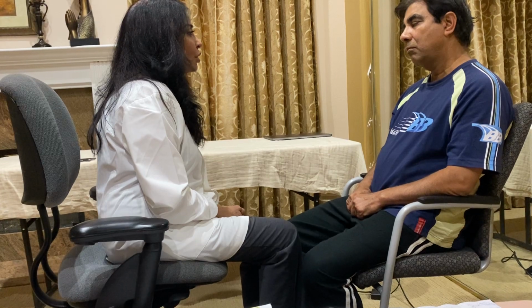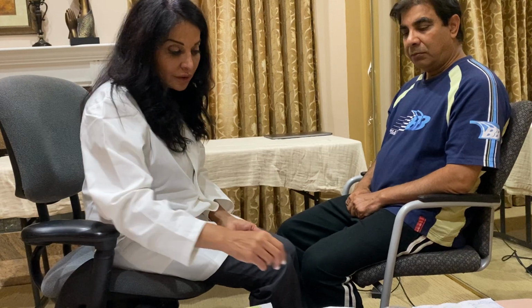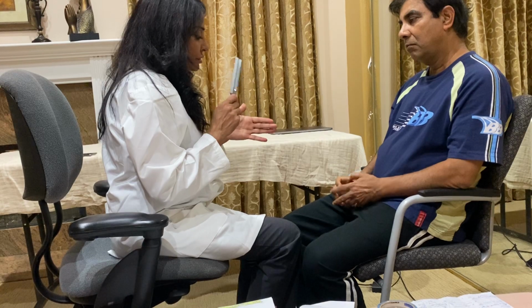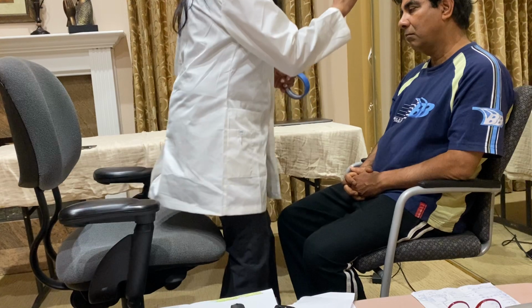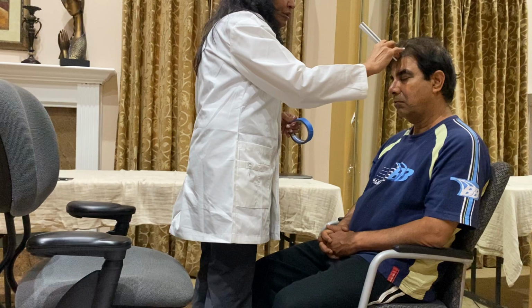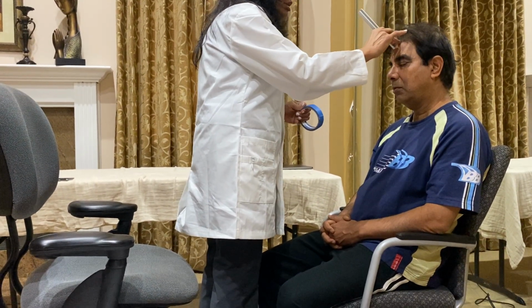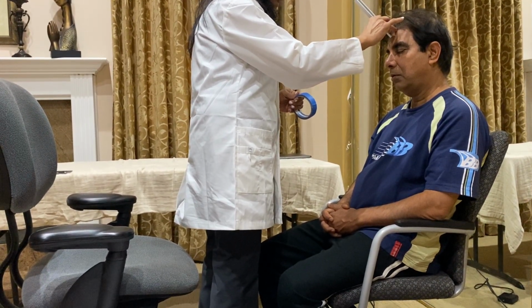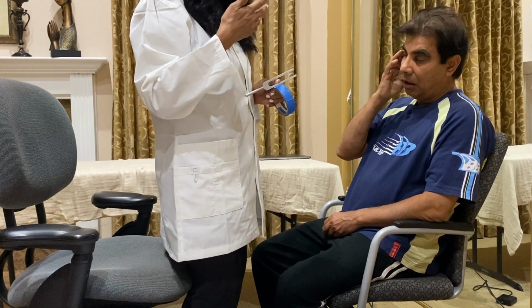I am going to now go to checking the Weber test. The Weber test is done with the tuning fork, and I'm going to hit it hard on a surface, and I'm going to put it in the center of his scalp. You're going to tell me, sir, when you stop hearing it. Stop. I'm going to do it again. You're going to tell me if you hear it equal on both sides. Yes. Do you hear it equal on both sides? Yes. Okay, that tells that the Weber test is equal, and both his ears are able to hear equal on both sides.